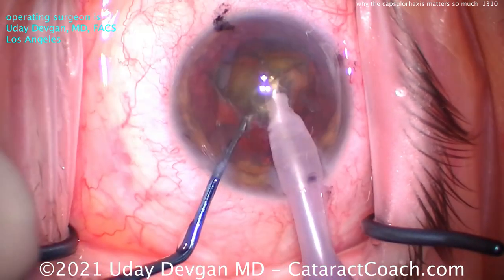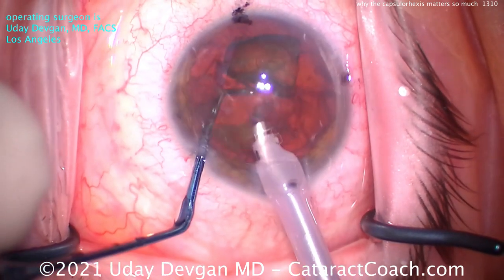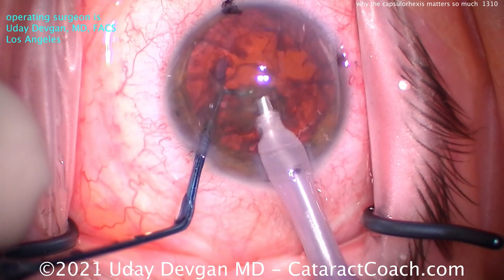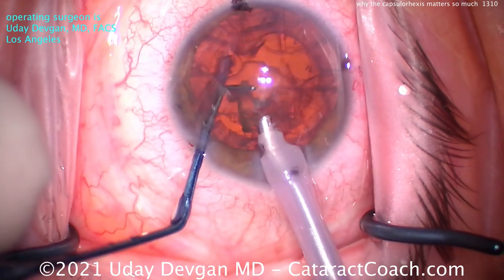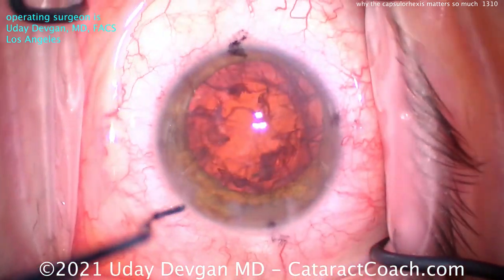The capsular rhexis, in my opinion, is the best — better than a femtosecond laser. And so I can remove the nucleus without any worries about the capsule edge becoming weak. It's intact. It looks great.